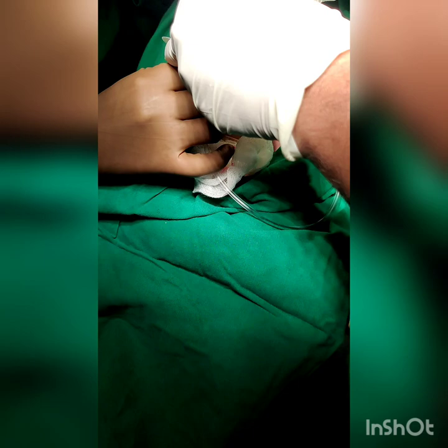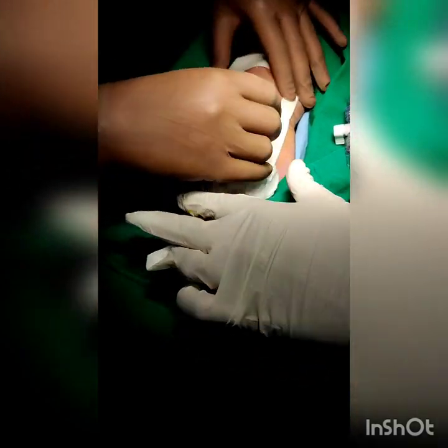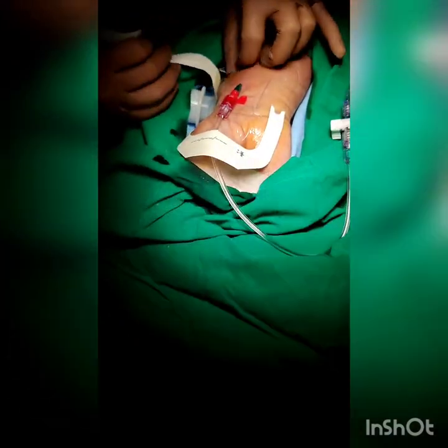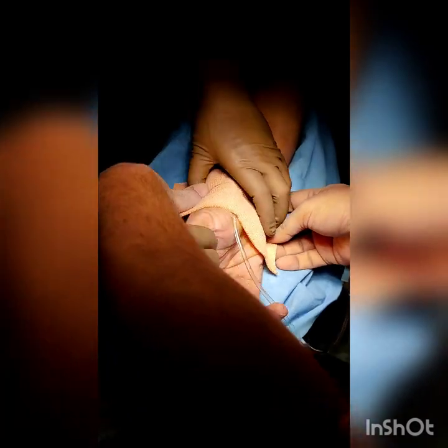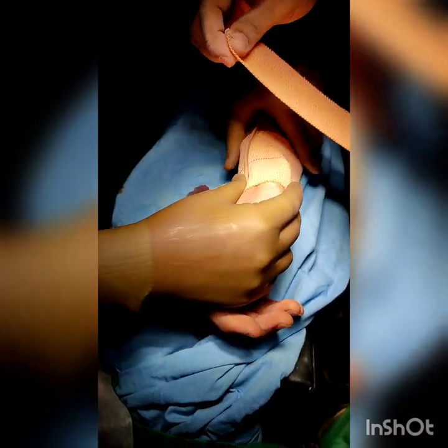A sterile transparent dressing is then applied. Alternatively, stitches can also be taken at the proximal wings of the arterial catheter. Make sure there is no kinking of the catheter at the puncture site. To stabilize the long tubing and prevent accidental dislodgement, a dynoplast strapping is applied over the distal forearm. The tubing is looped around the thumb to make it extra secure.